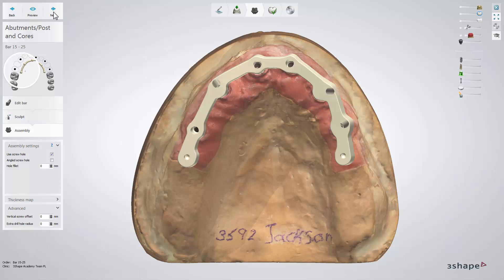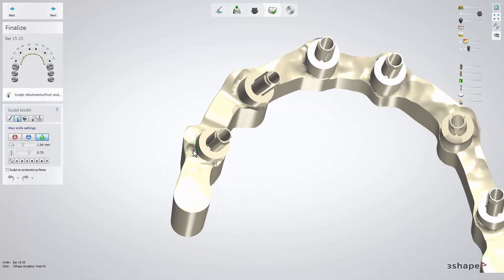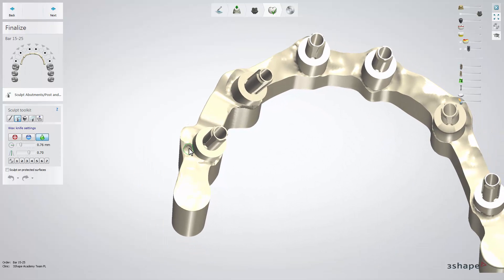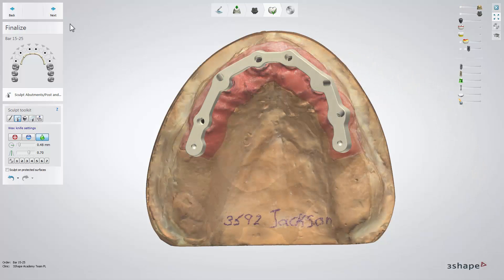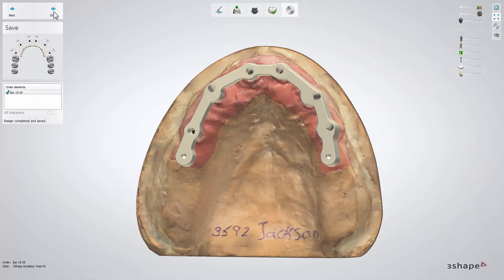Then click next. On the finalize step, you will have a chance once again to make small adjustments to your design using the sculpt toolkit. When finished, click next to get to the save step, and then close.